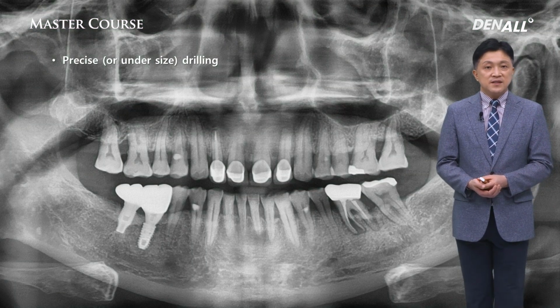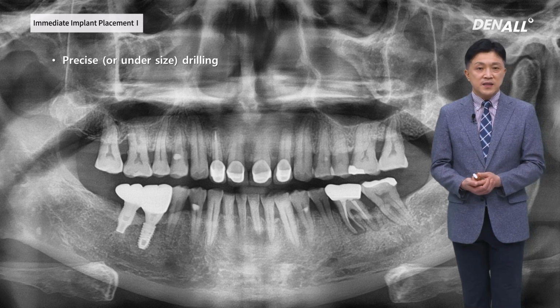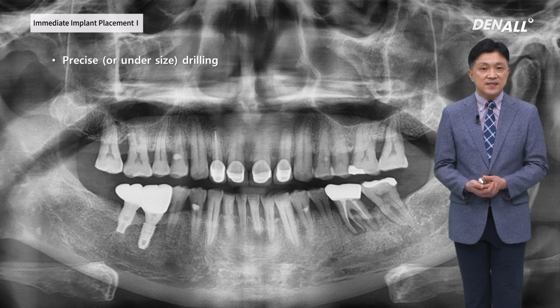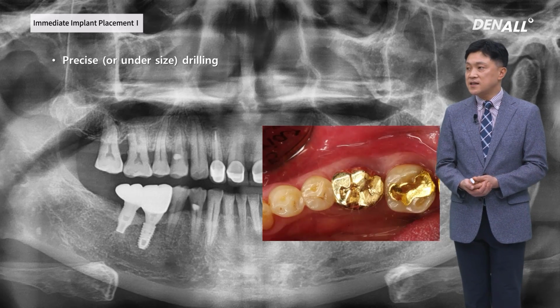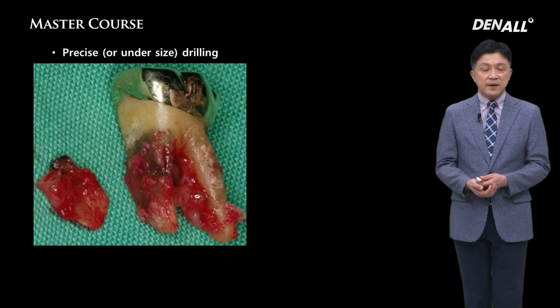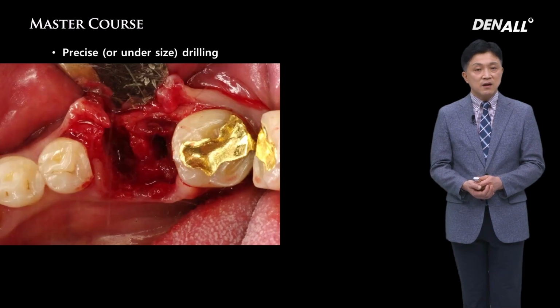Let's take a look at the patient. The primary stability is essential. In this case, in number 36, root fracture occurred. This is the oral cavity. There's nothing really that stands out. Atraumatic extraction was done. The fractured root tip was removed.